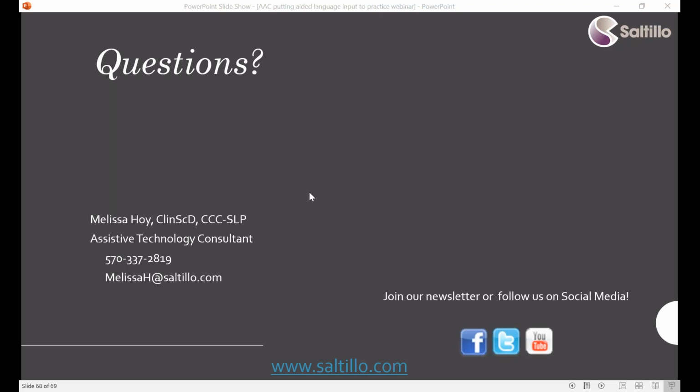Another thing to think about is you could create a visual strategy for them, a kind of mapping. Depending on the device, like with our Chat Editor program, you can actually create a pathway to a word. That way it's a mapping to help anybody find that word. If they're not familiar with the system, they can see that first I hit this one, then this picture to get that word. Hopefully that helps a little bit, or at least gives you a direction. If anybody else has any other questions, go ahead and type them in.